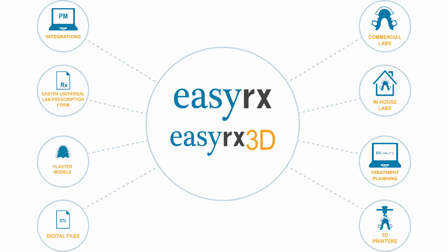So what is EasyRx? EasyRx is a universal lab prescription, digital workflow, and 3D software for practices and labs. EasyRx integrates with practice management software products, making your workflow seamless. For example, you can be in your practice management software, launch EasyRx, and fill out key aspects of the prescription form. Use the EasyRx Universal Lab Prescription Form to create all of your lab, clear aligner, and digital prescriptions through one form. No more dealing with multiple forms for each lab.